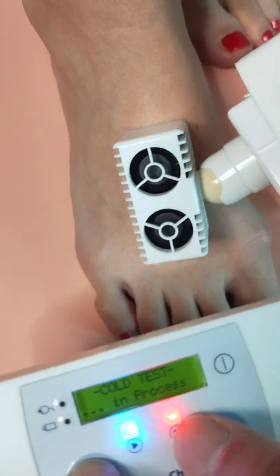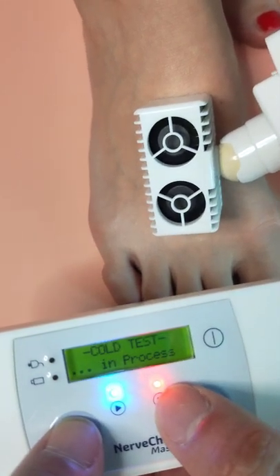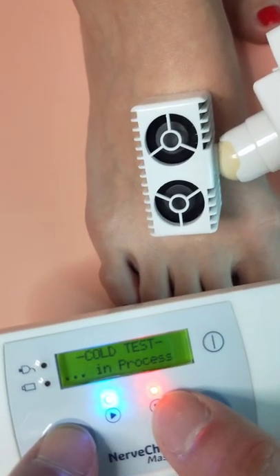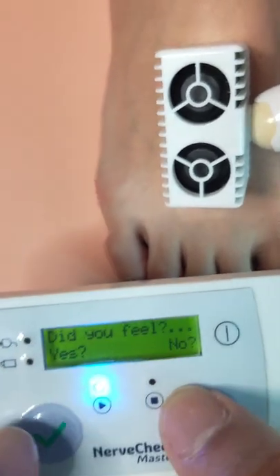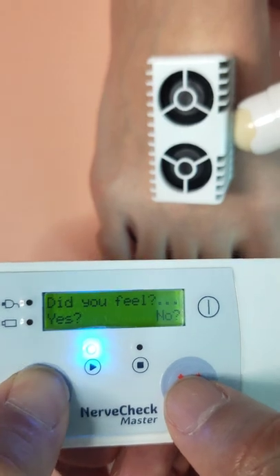Did you feel a cold sensation? Just now? Yes, you're feeling it? Yes. See the red light? The test is ongoing. Now it's finished and it asks you did you feel it — and you say yes.